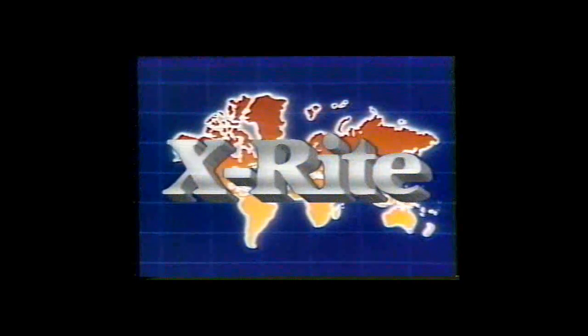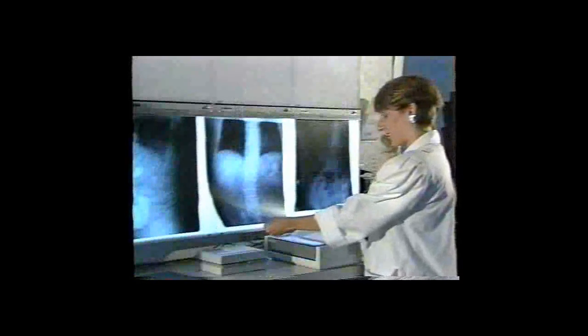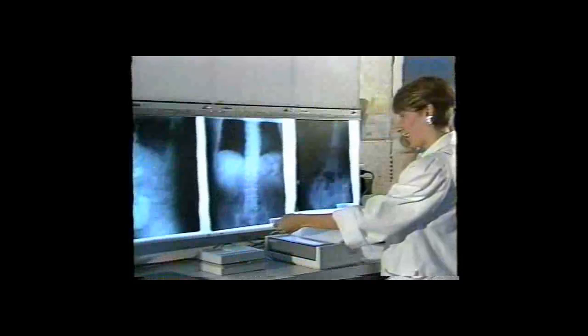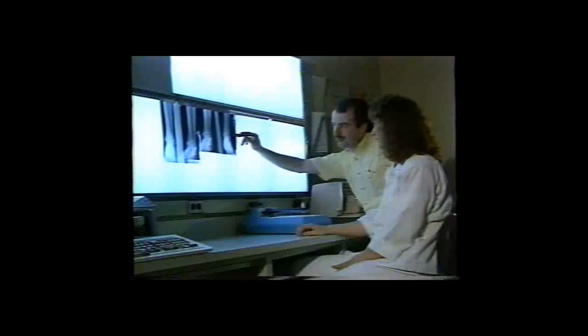X-Rite, the world leader in X-ray processor quality assurance instruments, now brings you a new generation of convenient, accurate, and cost-effective process monitoring equipment. We've combined the 383 sensitometer and the 381 densitometer with a serial printer to provide a complete process control system — the watchdog that enables hospitals and clinics to optimize processor performance, maintain high standards of image quality, reduce re-examinations, and meet the requirements of regulatory agencies and accreditation organizations.